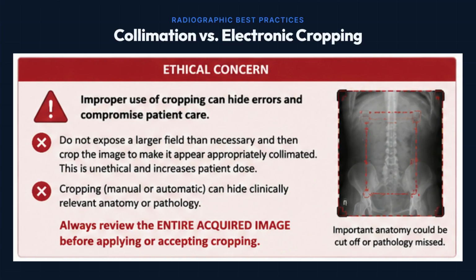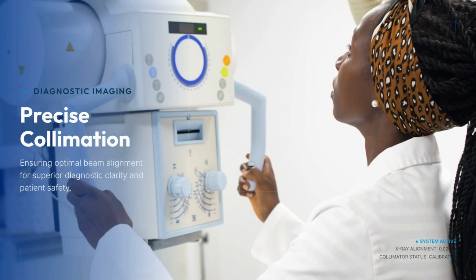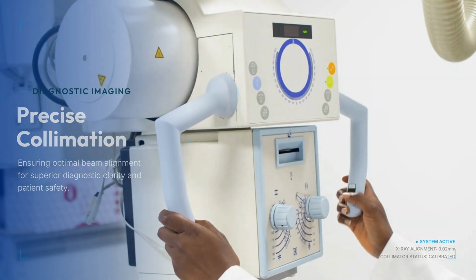Using electronic cropping to hide poor collimation is unethical. It obscures the fact that you irradiated unnecessary tissue. Collimation affects patient exposure. Cropping affects image display. Cropping should never be used as a substitute for proper collimation.